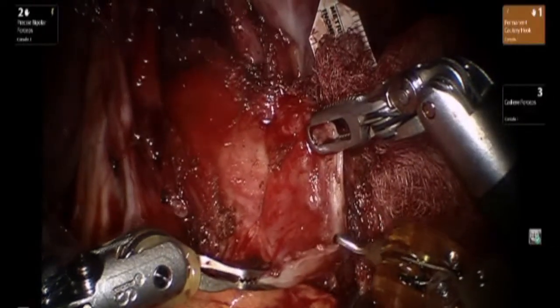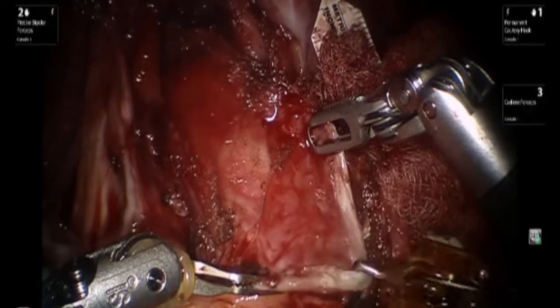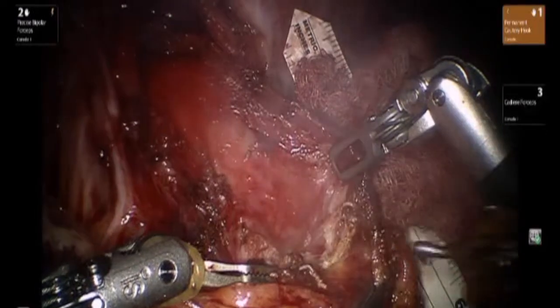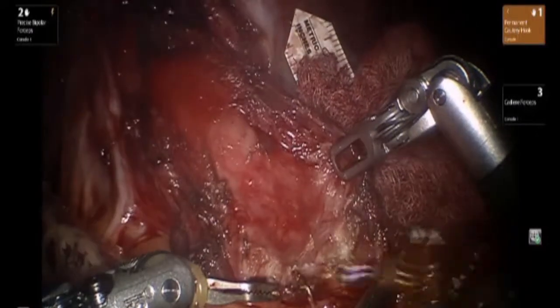The vagus nerve is visualized and preserved. We then proceed with dissection along the gastric muscle component. One can visualize that the gastric mucosa has a slightly darker red color compared to the esophageal mucosa, which is more of a white color.